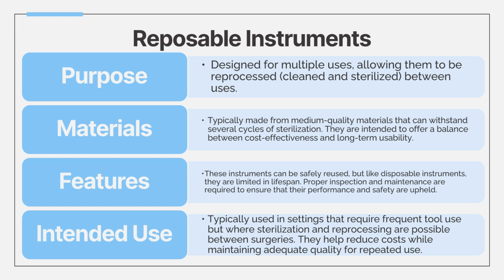So another thing that's very important to have in any MDR department is a proper instrument tracking system. So let's say you received a brand new Da Vinci or any other robotic instrument that's reposable. You would have to keep track of its usage because anything above that can compromise the patient's health and safety.